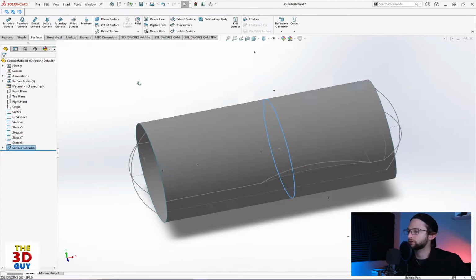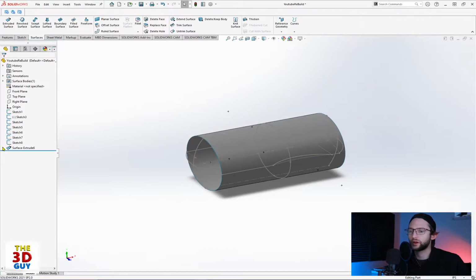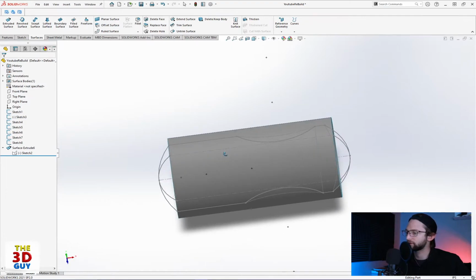All right, so that looks good. We got that basic shape right there. And I'm actually going to make this disappear at this point. I don't need that reference for anything else.